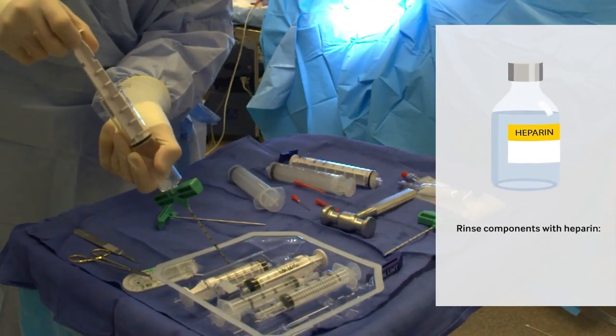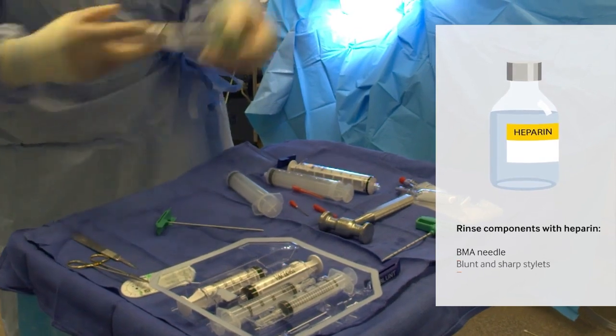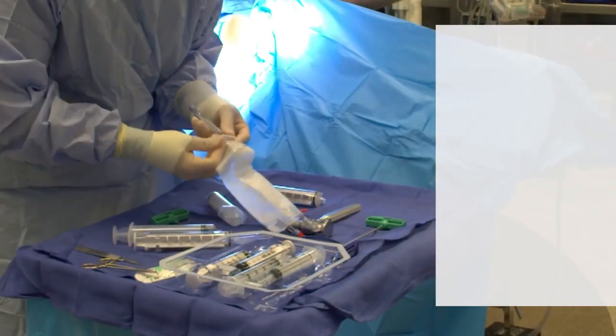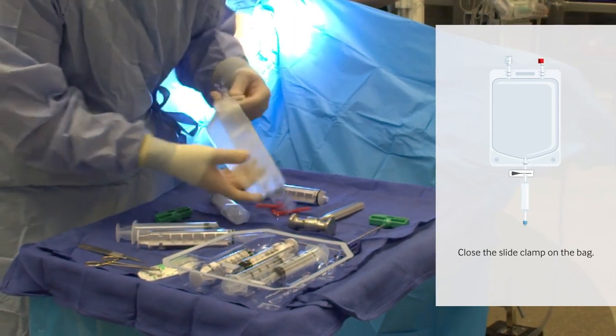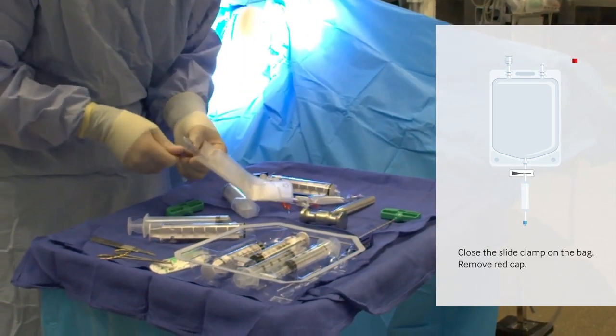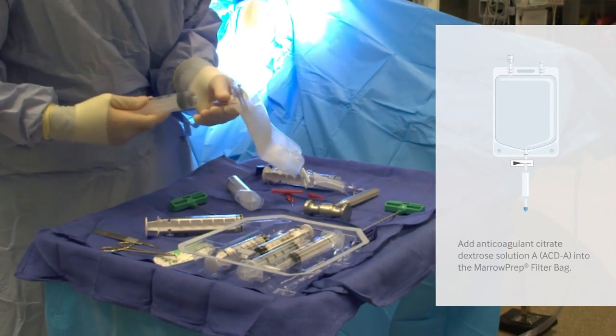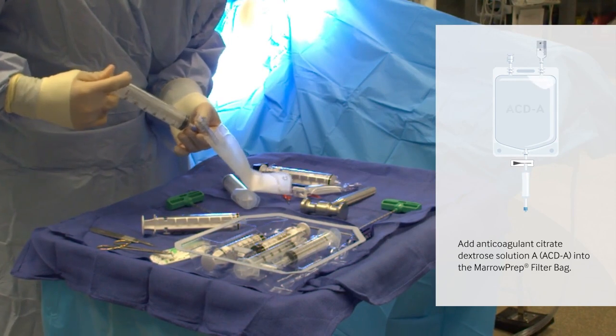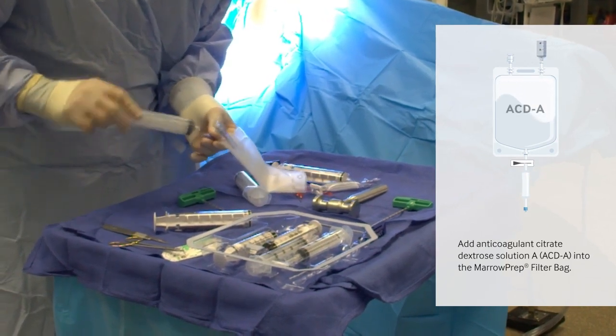To prepare for this procedure, rinse components that will come in contact with bone marrow aspirate with heparin. Next, close the white side clamp of the filter bag and remove the red cap. Then inject ACDA into the red cap of the marrow prep filter bag. This will prevent clotting once the bone marrow aspirate is injected into the bag.